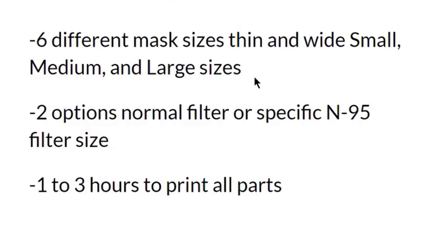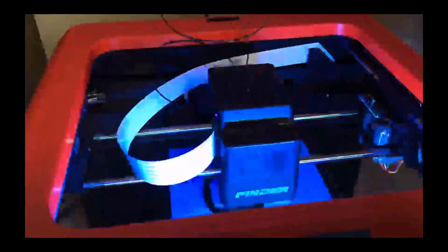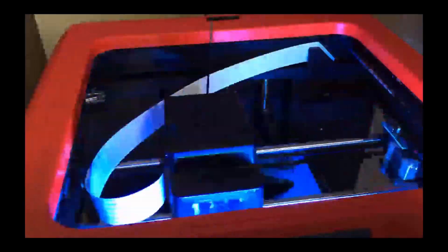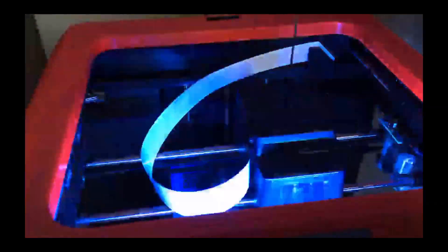The overall time that this takes is one to three hours to print. Here's a time-lapse of the mask being printed. The angle may not be the best as it does not fully depict the mask, but we tried our best to get the best angle.